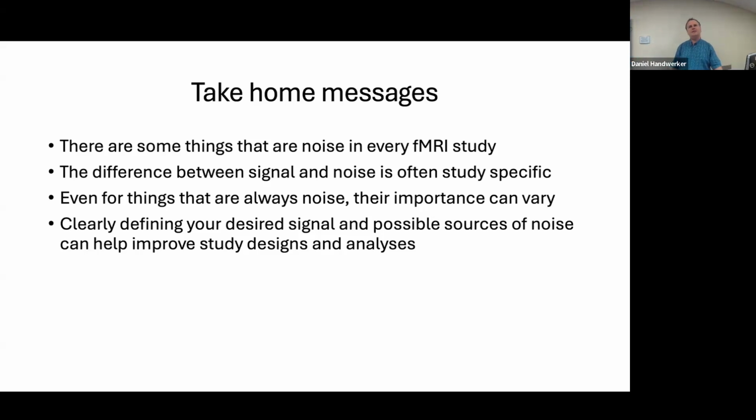Can you measure your heart rate and synchronize it with your data? Yes. There are a bunch of methods that address it with slower sampling rates. You definitely measure heart rate. There are also methods that use a large sinus or a large vein region of interest to get the base time series. These methods work. I use them, but they're not perfect. If your goal is to reduce the noise, there are some excellent methods out there, but if your goal is to completely eliminate the noise, I don't think any of the methods truly eliminate it.